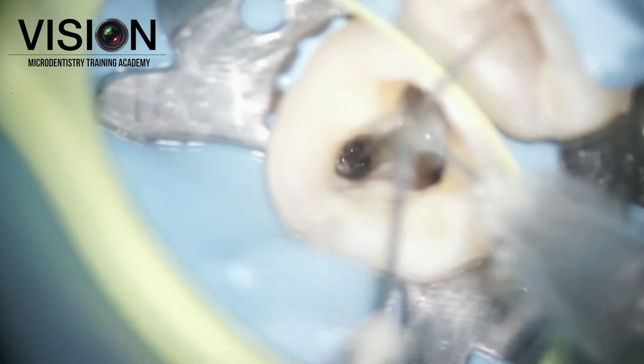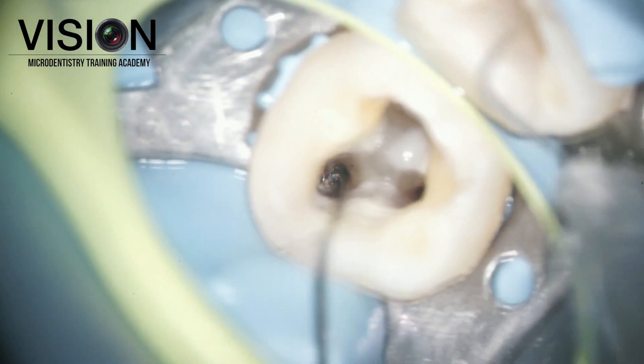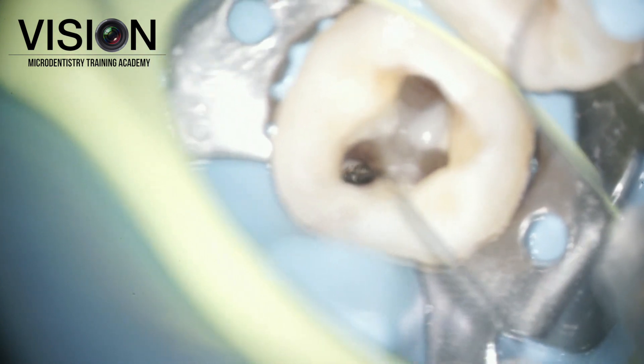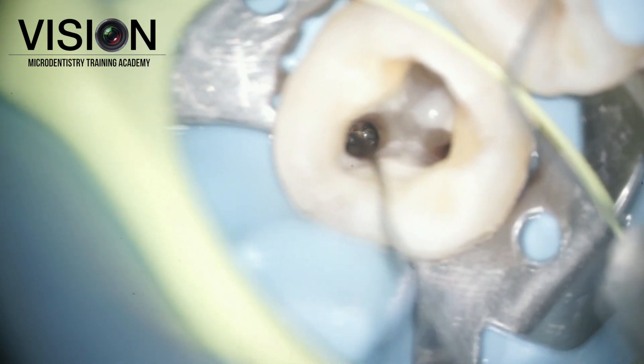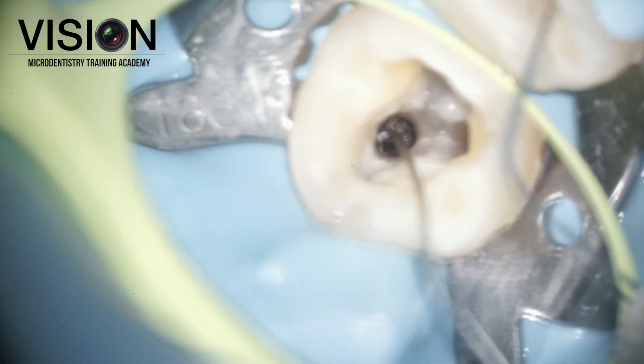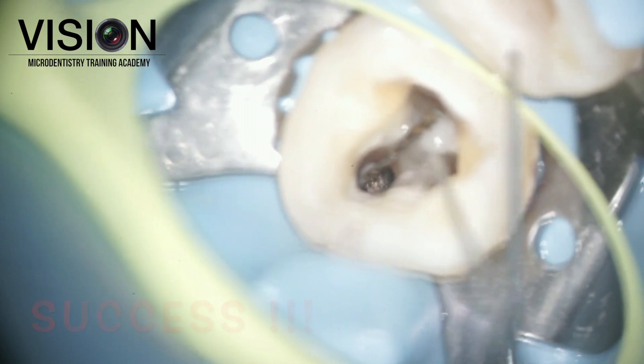You can see the loop being encircled around the head. Once it is firmly secured inside, we tighten the screw on the BTR pen and give a firm tug in all directions. As you can see, we can already see the movement on the head of the instrument. The instrument immediately pops out.